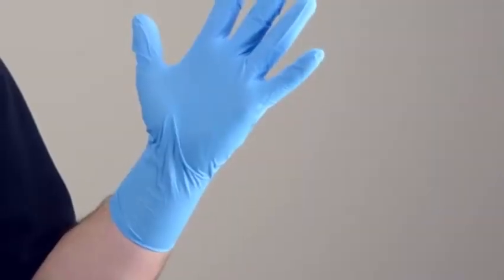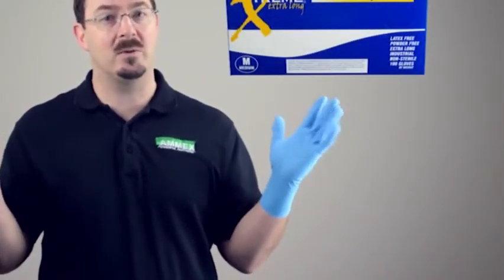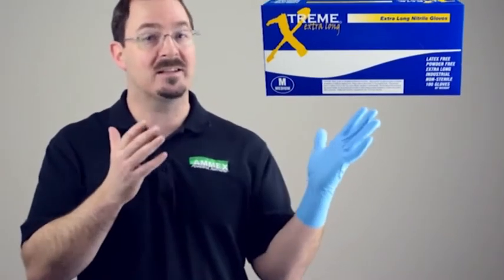This is the Xtreme Extra Long Nitrile Glove. It is an exam grade disposable glove with an extended cuff, making this glove over two inches longer than standard disposable gloves for better coverage in wet or dusty environments. This gives you excellent forearm protection and helps prevent liquids from running down the inside of your glove.